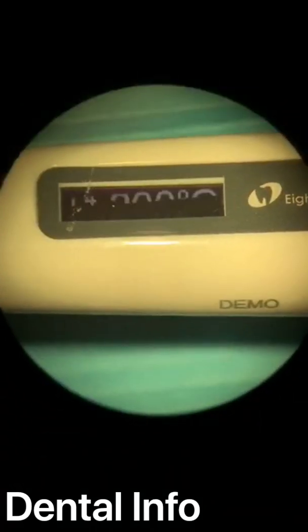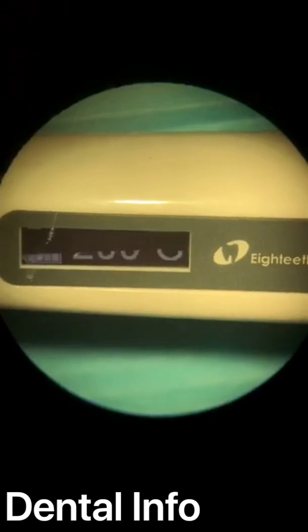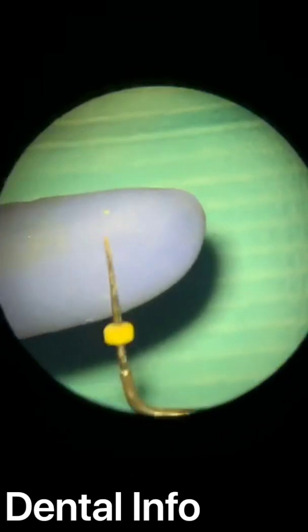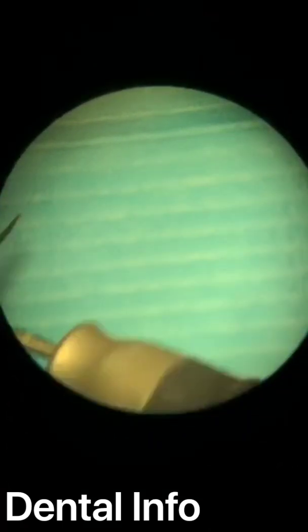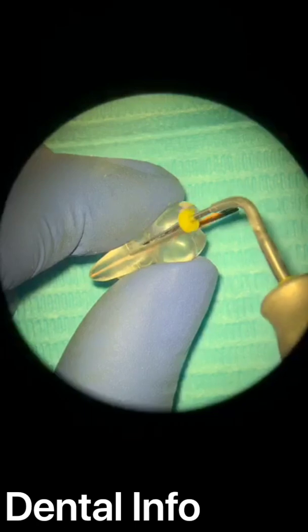I'm not pressing yet. I will just show you something very interesting here. Not all companies have this function. If you're pressing and you forget the time, we don't have that sense about time. Sometimes 1 minute for us is like 1 second. So here, if you start, you have a counter here. 1, 2, 3, 4, 5. After 5 seconds, the device will disconnect. You will not have any efficiency, because automatically the device will cut the temperature. Why? To be safe from overheating the periodontal ligaments, because our patients are anesthetized. If you overheat here, you will damage the periodontal ligaments.